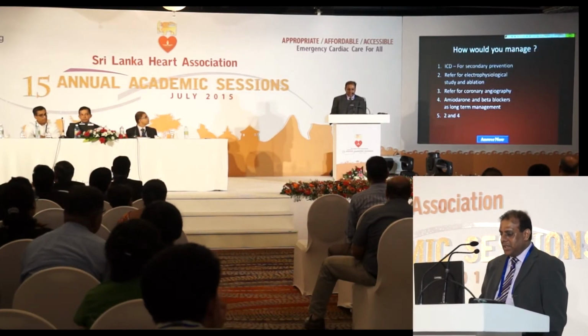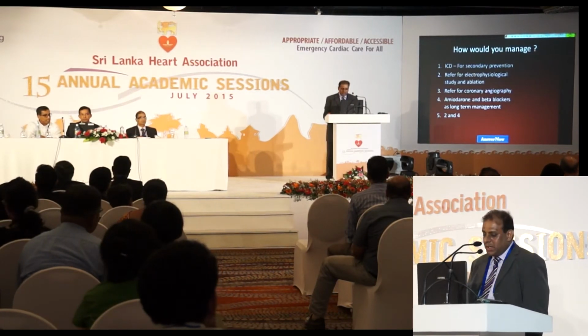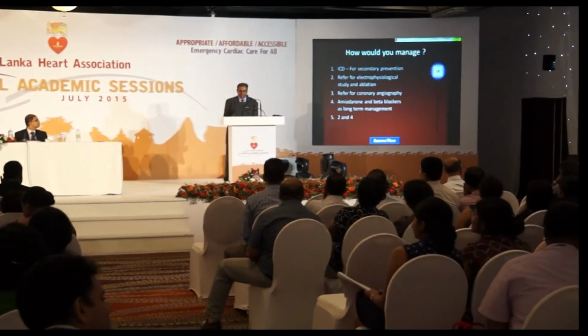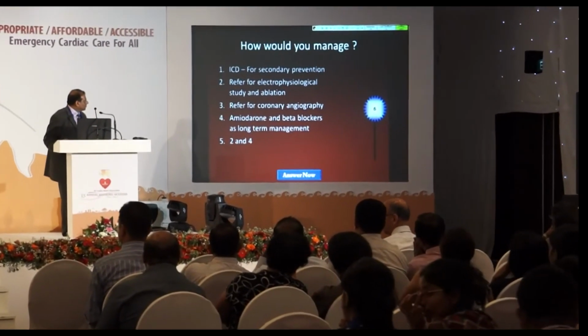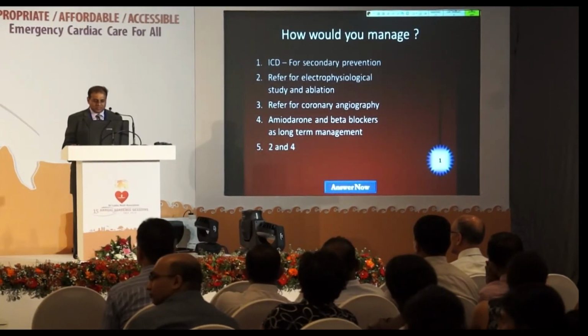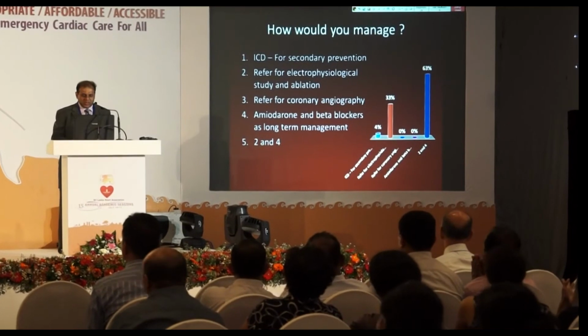So the options given here are on the board, and then you can start voting now. Okay, let's go for the last 10 seconds. Let's see what the responses are like.